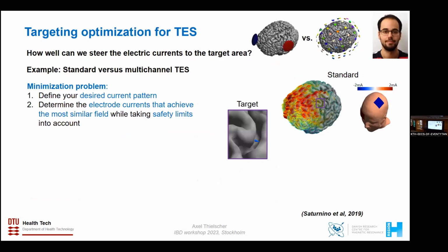So I talked a bit about those response relationships, where we can use volume conductor models as a new tool to explore those. We can obviously also try to turn the problem around, because at the moment I was always talking about montages which looked like that, and they had quite unfocal fields, and then I told you, well, this is actually a motor cortex montage which tried to target this part of the area of the cortex, even though they create currents which are flowing in half of the brain.